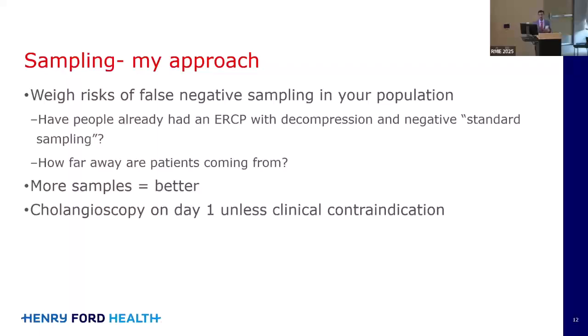How high is your pretest probability? Whereas if you get a good visual assessment that the lesion is malignant, and then you get a false negative, that will completely change your approach to how quickly to bring the patient back, how to advise them following the procedure. So I found it in my practice to be beneficial.